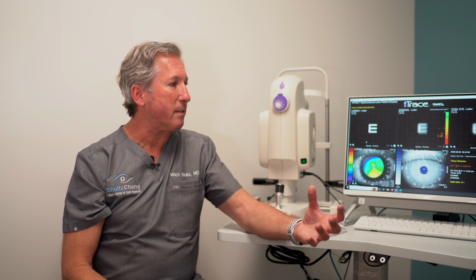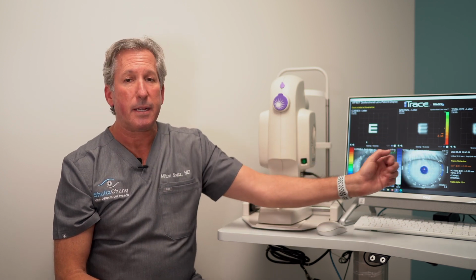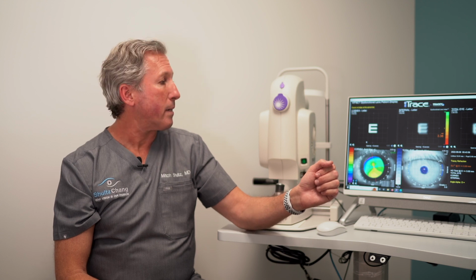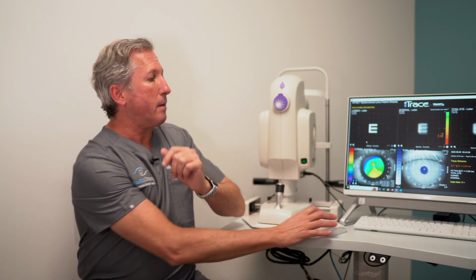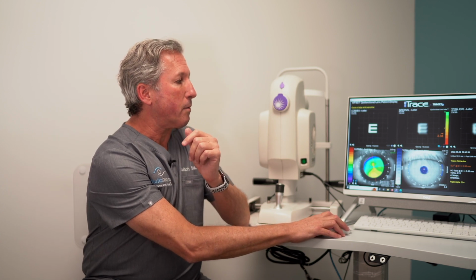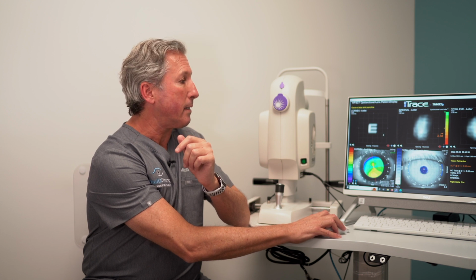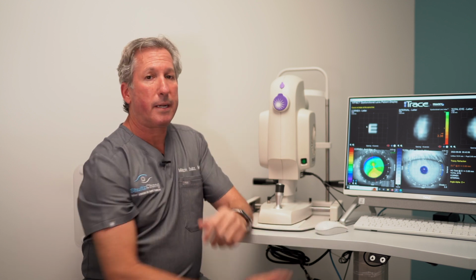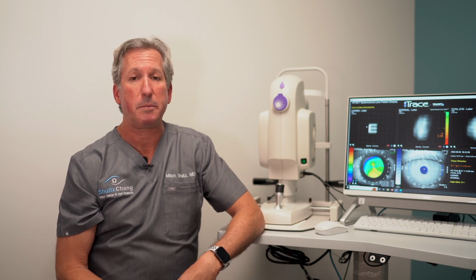So even if we take out the cataract, which as you can see here, still is kind of fuzzy, even with the correction of the cornea, that cataract has no impact on the cornea. So here we can see that when we have both things uncorrected, you have very blurry E from the astigmatism. So it's important to treat astigmatism in these patients.